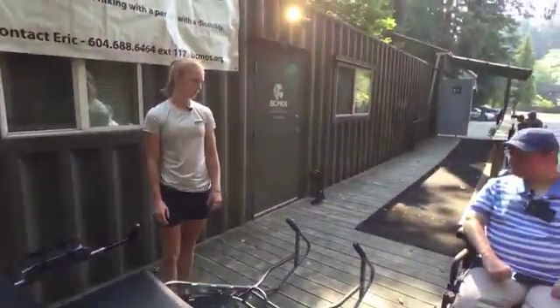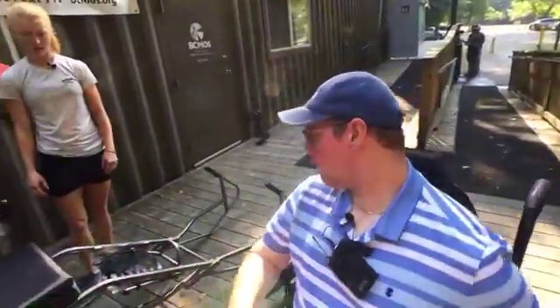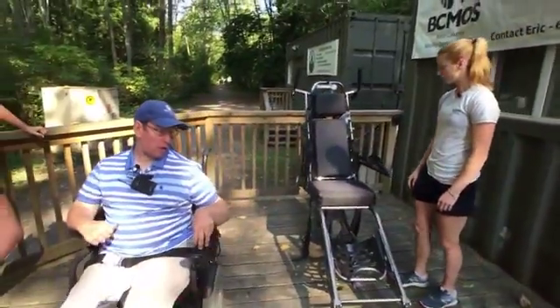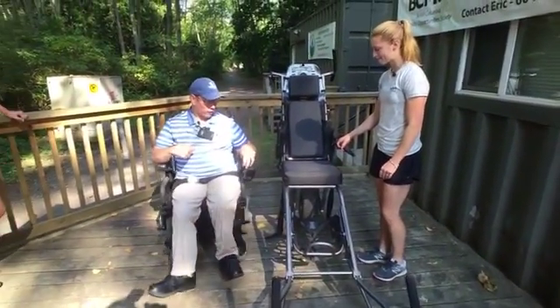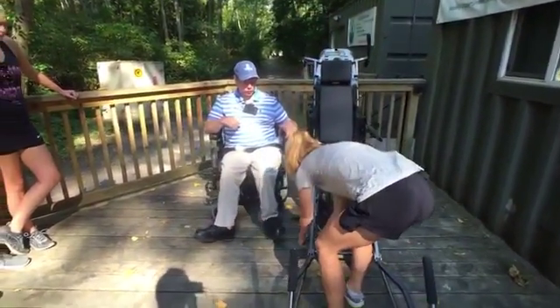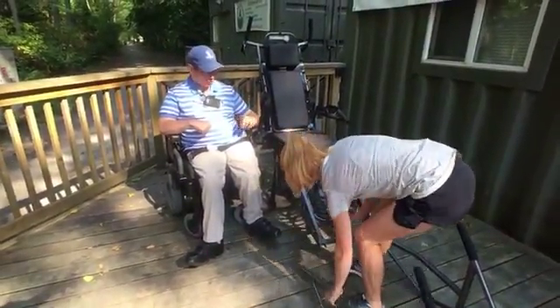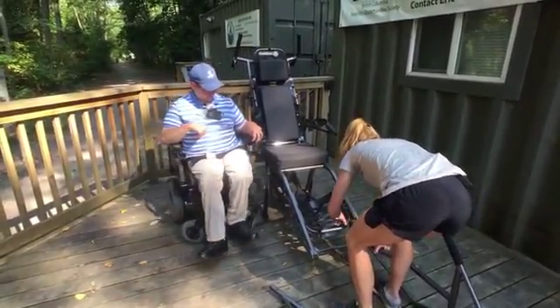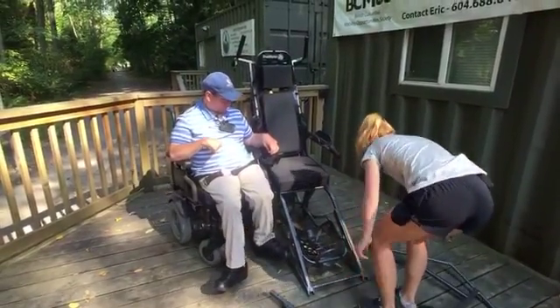So Eric, which way did you want to get in, on the right there? I'm going to transfer in on the left side, the side that you've left open. And as you can see, Alex has left the armrest there so I can reach and grab it. So I'm going to transfer myself over. Now I think what we're going to do is I'll get you to take the front forks off, so we lower it down a little bit so it's at a more even level. Perfect. Okay.